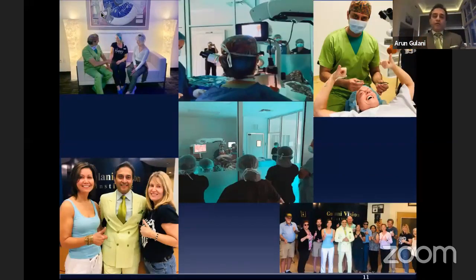In a quick nutshell, I'm sharing with you in one slide the cycle of a patient. Again, this is one particular patient I just picked because of the cycle. You can see me meeting with them before surgery, right there on the sofa in my surgical suite. I meet with them before surgery, sit down, and again review with them, having already met them when they fly in. Then you're seeing in surgery, even though I always have people watching or coming in to observe, surgeons, industry, you do not want to disturb the patient. You are okay with everybody watching, but you are focused on the patient. The patient and you are one. That's very important. Again, that's what's premium.